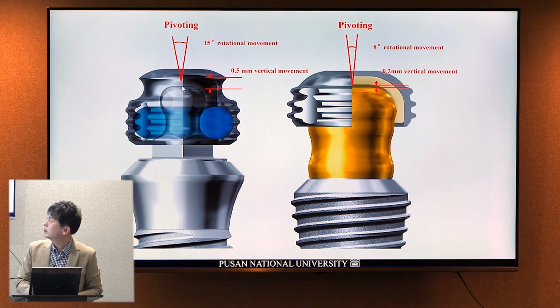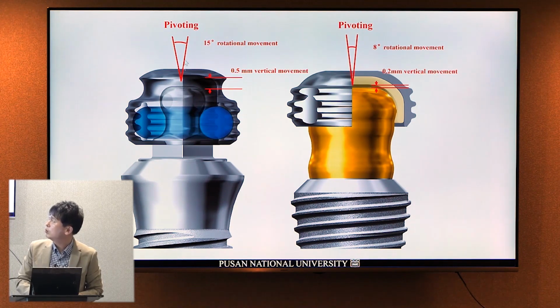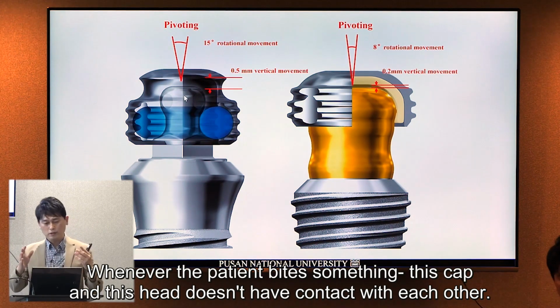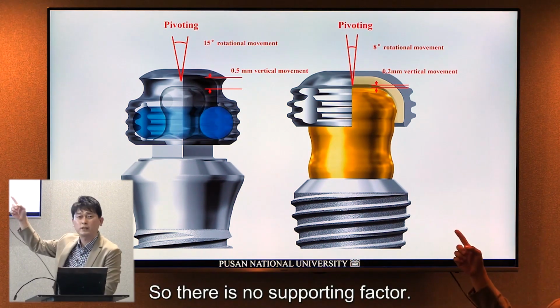There is 0.5 millimeter space in here. So whenever the patient bites something, this cap and this head do not contact each other. So there is no support factor.